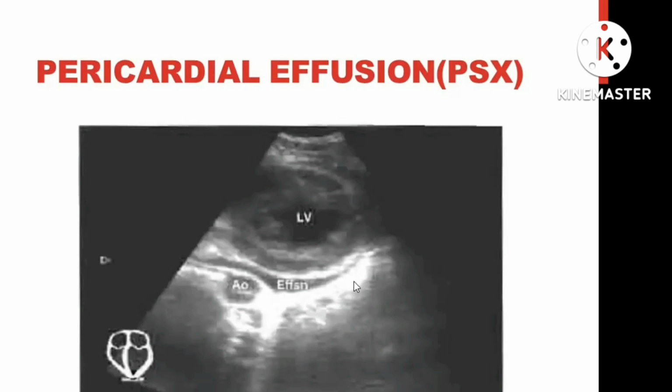What is this? This white hyperechoic. What do you call it? These are very basics now.